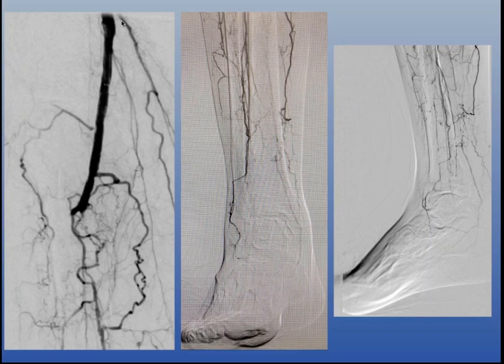But overall, we're in dire straits. This is a major revascularization, in terms of percutaneous options. And there's really no good surgical options here. This patient had a lot of comorbidities. They didn't have a good vein. Nobody wants us to use PTFE in this case. And so this is a patient that really cannot undergo a major surgery anyway. And so you really need to do something percutaneously.